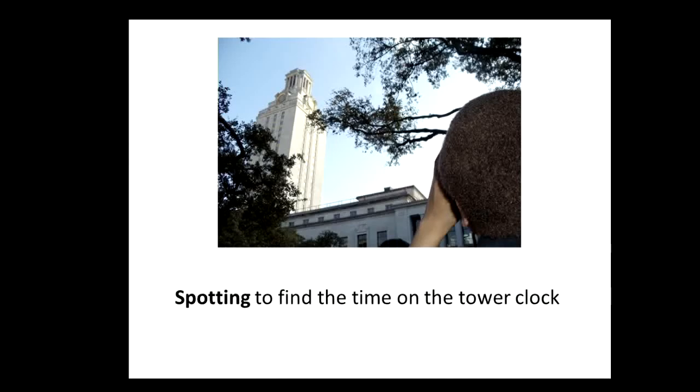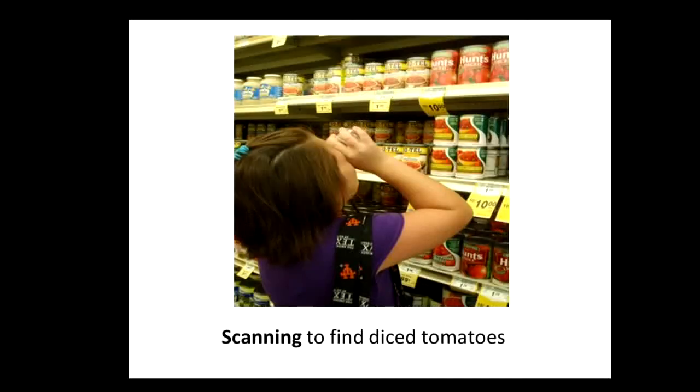The next picture shows a student scanning along a grocery shelf looking for the diced tomatoes. When you're a 4-foot shopper, a lot of the products you're looking for are above your head, and she had figured out, I can use my telescope to help name if we're at the right space.